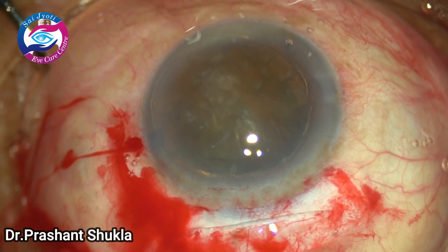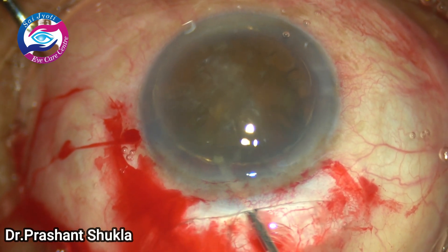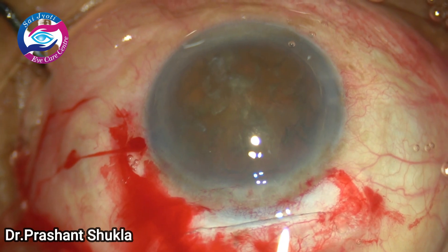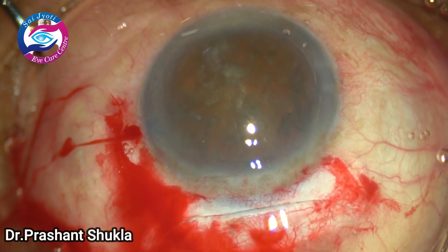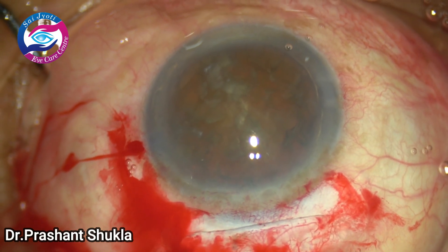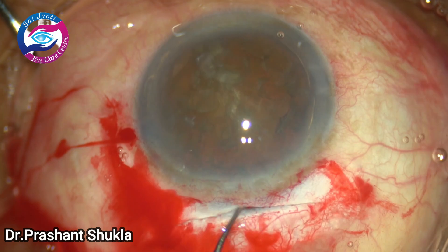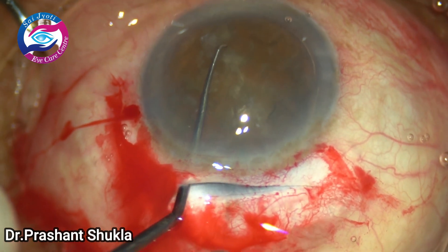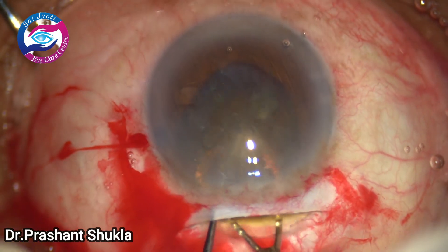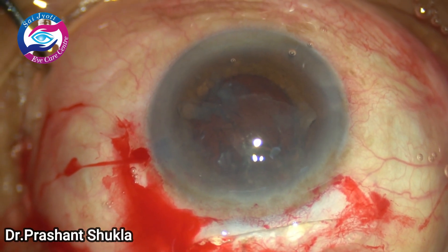Once the nucleus is in the anterior chamber, we are going to remove it using the phaco sandwich technique. Viscoelastic is instilled both behind and in front of the nucleus to protect both the cornea and the posterior capsule. The Sinskey goes in first over the nucleus to the maximum end, and the vectis goes underneath. The nucleus is sandwiched and removed from the eye.